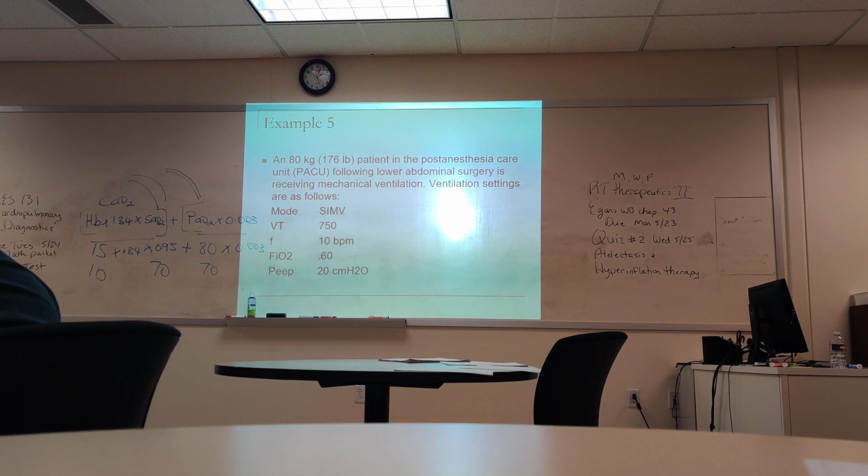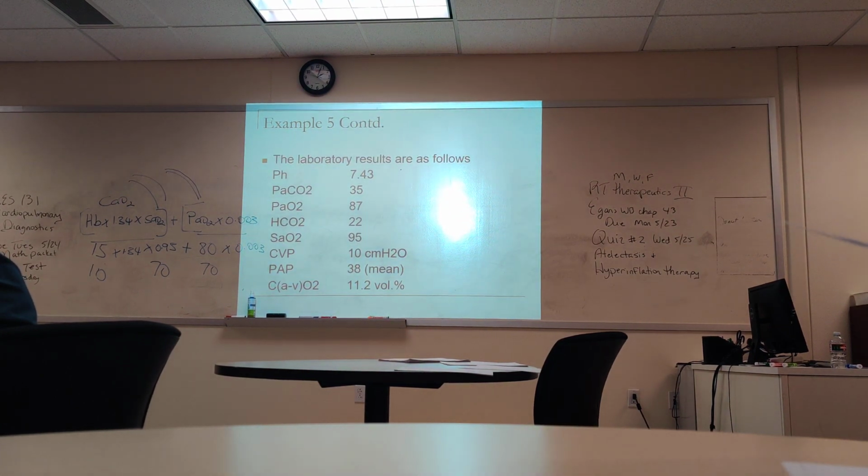An 80 kg patient in the post-anesthesia care unit, following lower abdominal surgery, is receiving mechanical ventilation. Ventilator settings are as follows. Tidal volume 750, frequency 10, FiO2 60%, PEEP of 20. The blood gases show normal acid-base balance with normal oxygen.